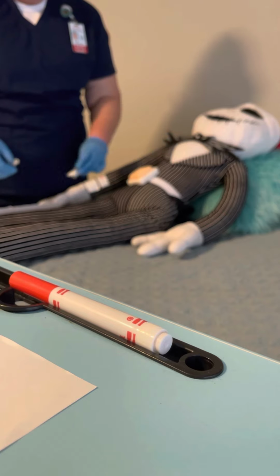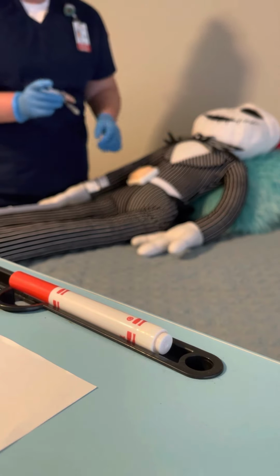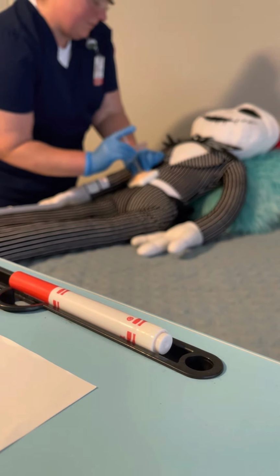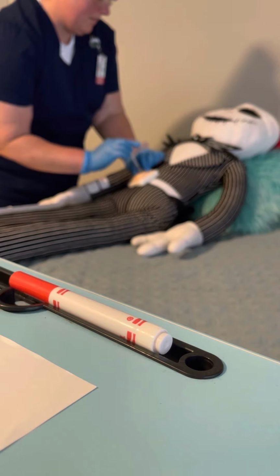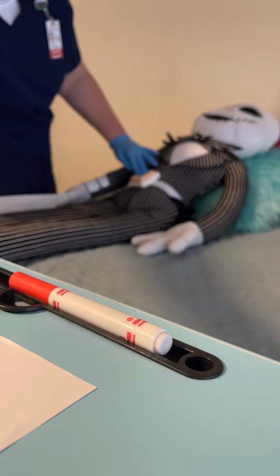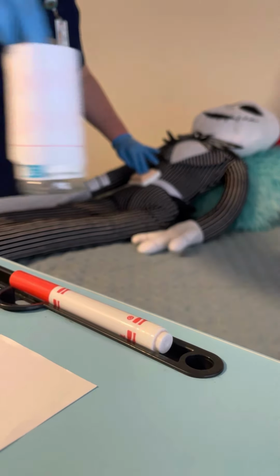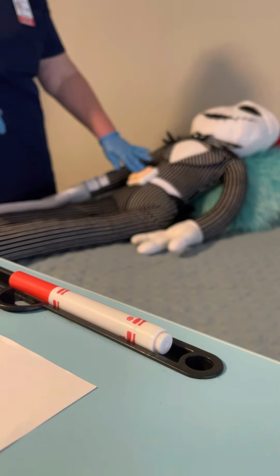My syringe. Pull my safety back, pinch, inject slowly. All right, apply gentle pressure. Throw in the sharps container. Sharps container, apply gentle pressure.